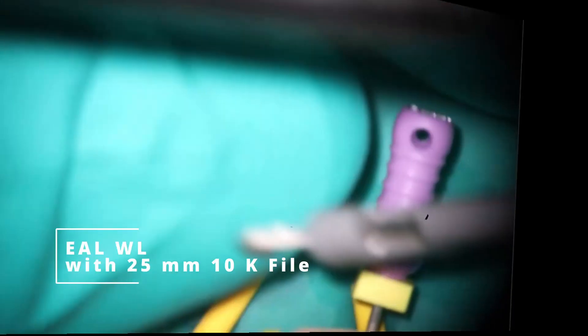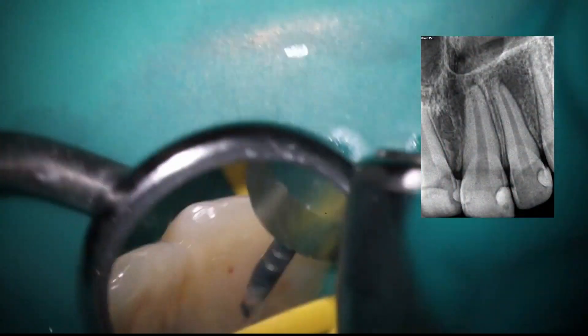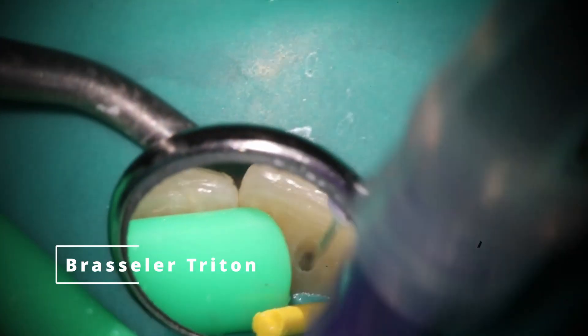It just pulls out a lot of that nastiness. Go ahead and get your working length like you have before. After that we're going to go down. Now this case I did actually go straight to an F1. Normally it's a little bit large for what my size would be, but if you look at that pre-op image again, it's such a large size to begin with that I'm not too concerned about it.